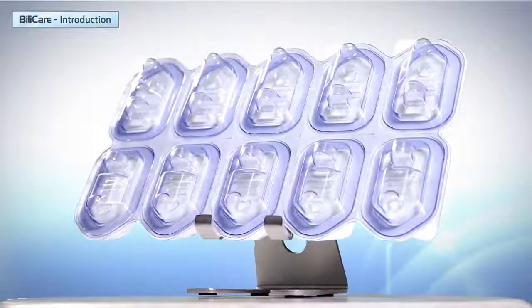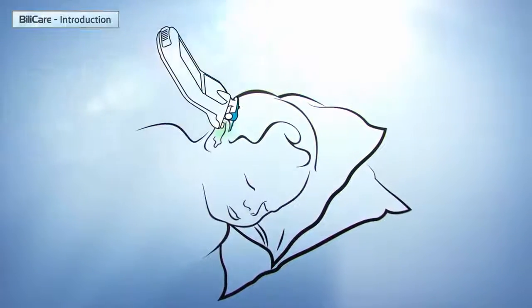Bilicare may be used with optional disposable covers. These covers minimize the contact between the baby's ears and the measuring device.